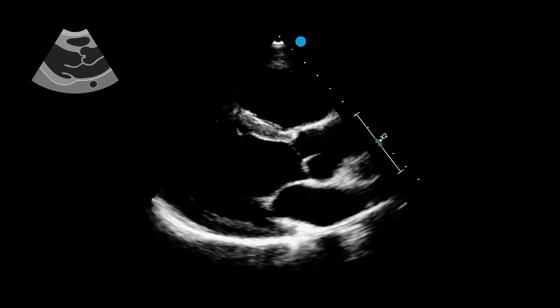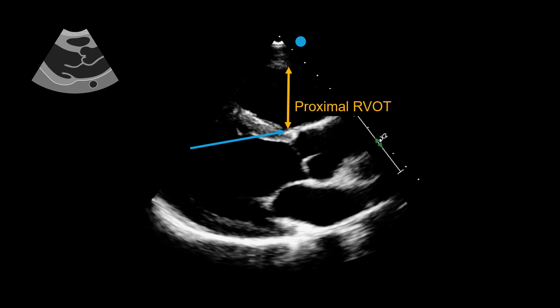Measuring the right ventricular outflow tract, or RVOT, is one of the methods used to establish whether the right ventricle is dilated or normal in size. It is best done using the parasternal long axis view, as seen here. This measurement can be obtained by starting at the hinge point between the aortic valve and the interventricular septum, and measuring vertically up toward the right ventricular endocardium.